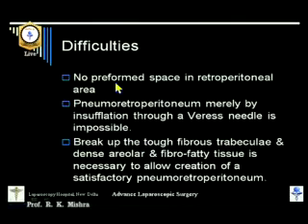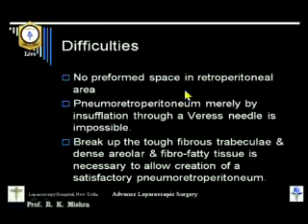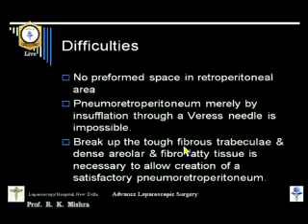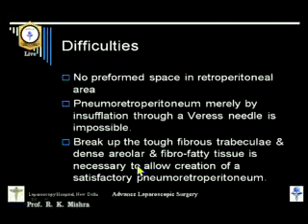There are no preformed spaces, so there are a lot of difficulties in access. Unlike the abdominal cavity, we don't have a preformed space, and you cannot use the Veress needle alone to put gas there. You have to break the tough fibrous trabeculae and separate the Gerota's fascia from the peritoneum. This dense areolar fibro-fatty tissue has to be separated by finger dissection. These are some of the difficulties in accessing the retroperitoneum.